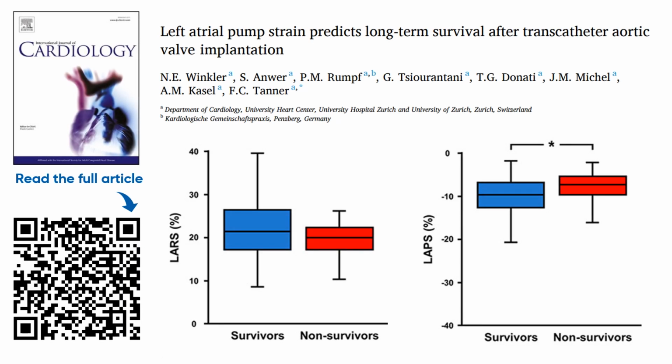Last but not least, in this study, our latest publication on the topic, we aimed at investigating the left atrial deformation by left atrial reservoir and pump strain and its implication for long-term survival in patients with severe aortic stenosis undergoing transcatheter aortic valve implantation, where speckle tracking echocardiography was performed in 198 patients with severe aortic stenosis who underwent TAVI at University Heart Center Zurich.